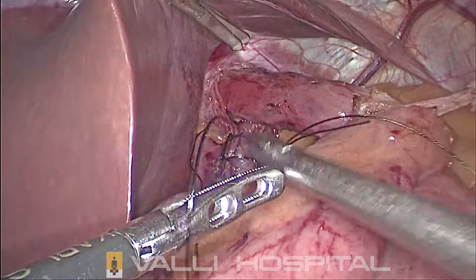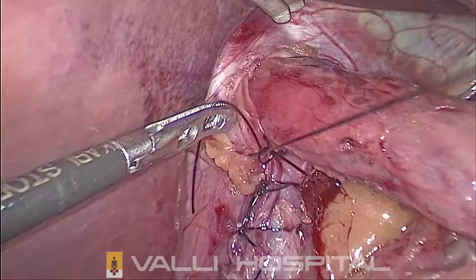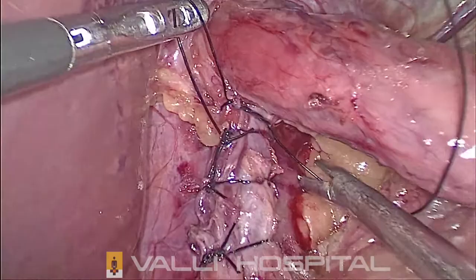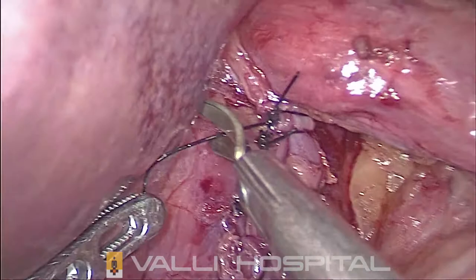The gap must allow a 5 mm instrument freely. It should not be too loose and it should not be too tight. That's very, very important. You should not cause dysphagia. There is enough gap, so we need not worry. There is a little bit of oozing. Cut both the threads, then remove.